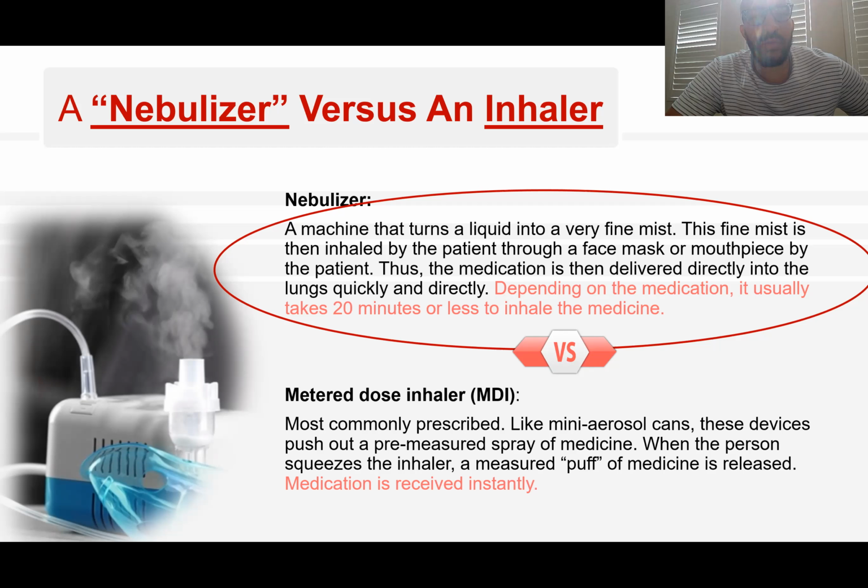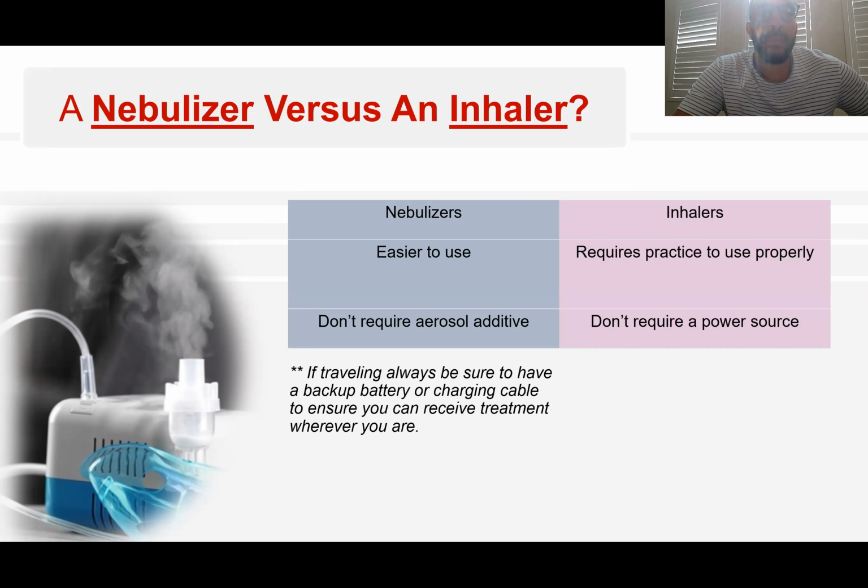This medication is received instantly, but it's not as effective as a nebulizer. But that's okay, it still gets the job done. A little bit more comparing a nebulizer versus an inhaler. A nebulizer is easier to use. An inhaler requires practice to use properly. So that's a big difference there.